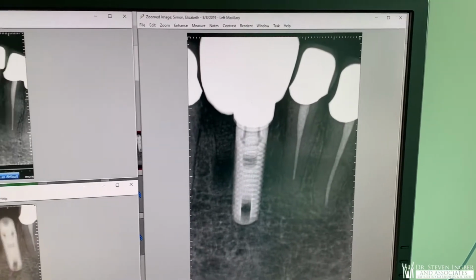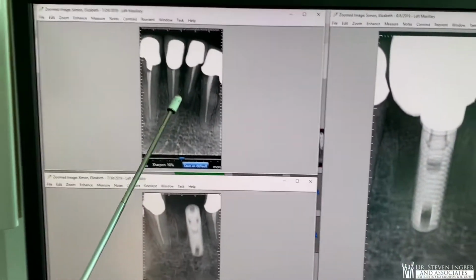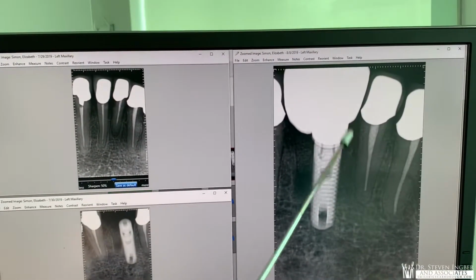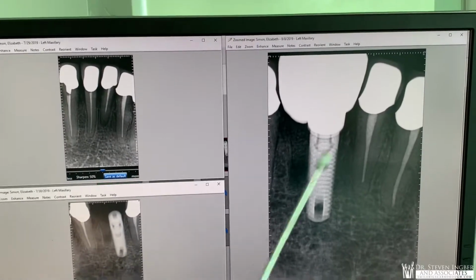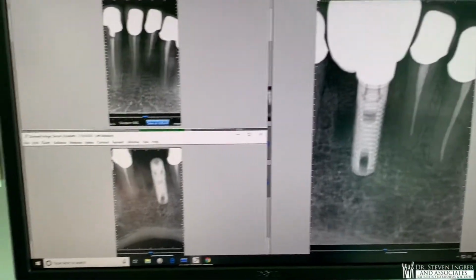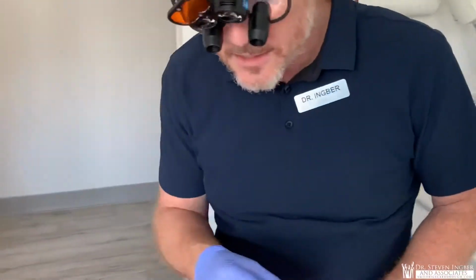Traditionally, every tooth, every crown gets a root, see? But in this case, we went tulip shape. See? Tulips in the spring, beautiful tulips. Who doesn't love tulips? And that's a beautiful tulip shape. And so that's on the x-ray. So now let's go look at it live. We're going to come to her mouth. This is an amazing thing to see.